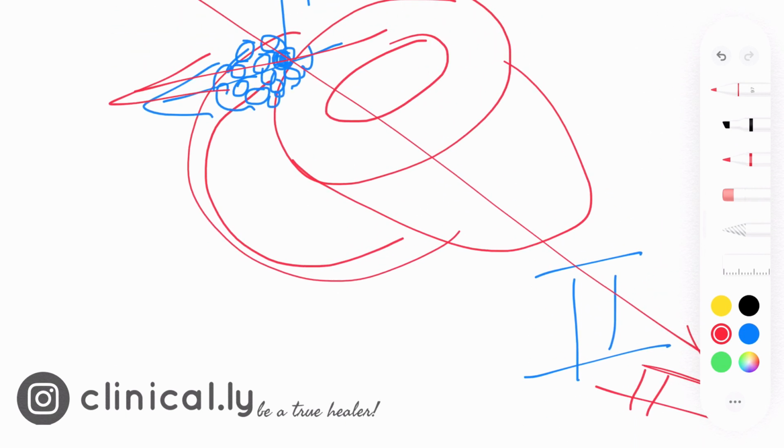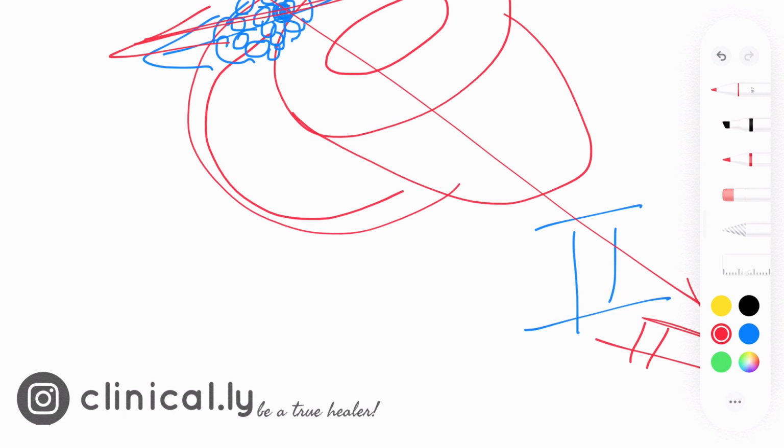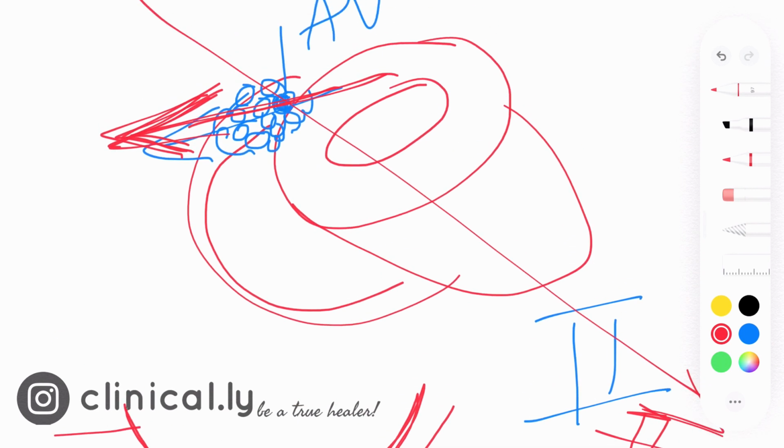So it is like an explosion, but the wavefront vector is going away from lead 2, so it creates a negative type of deformation on the baseline. But this does not last for a longer time.